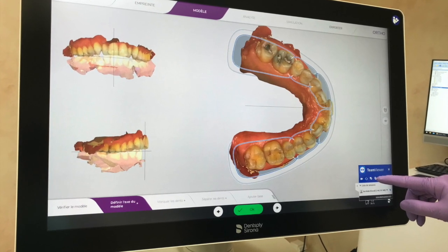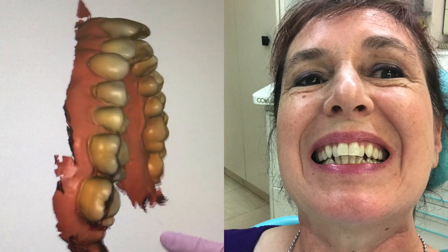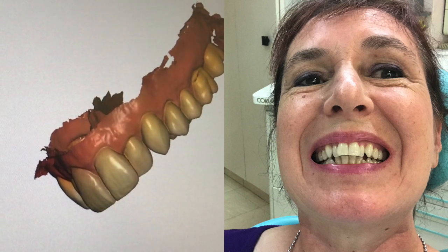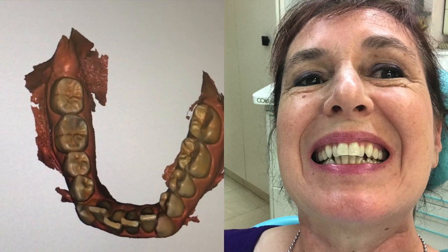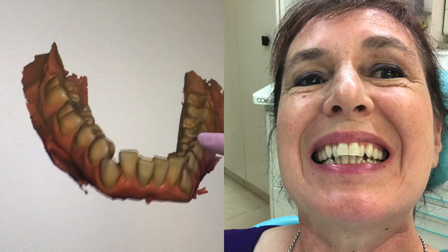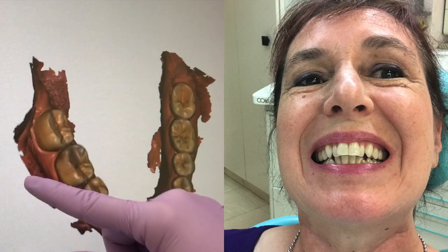So now that is finished and they will be able to show me how this is going to work — how many weeks I will need to do the Invisalign and how they're going to be moving the teeth. Stay tuned to the next in the series and I will show you the whole process. If you want to follow this particular playlist then just click on the Invisalign playlist.